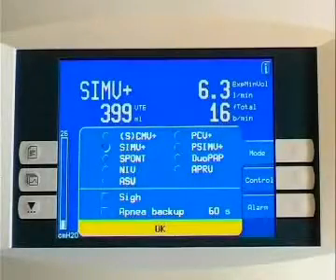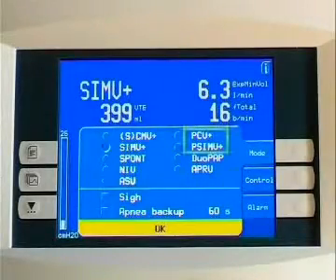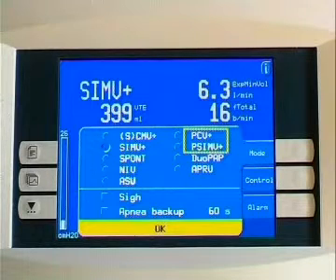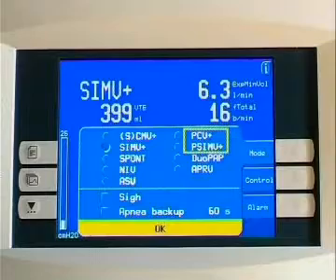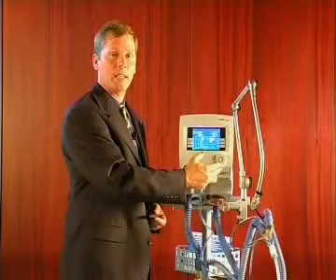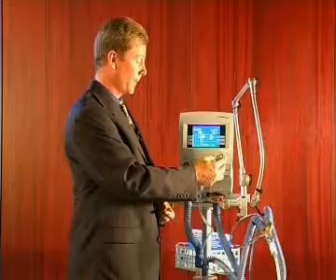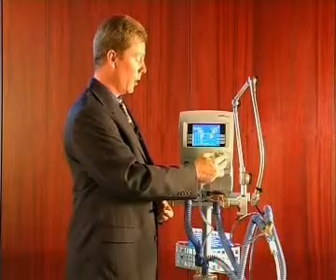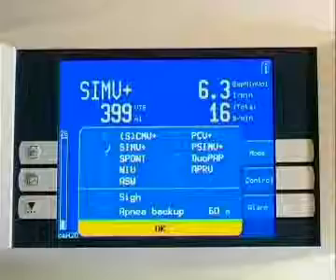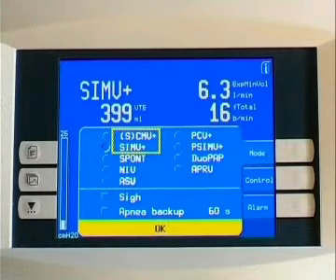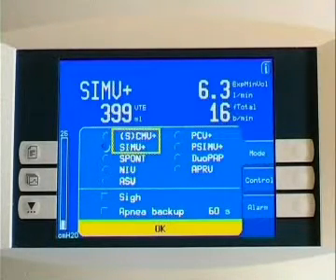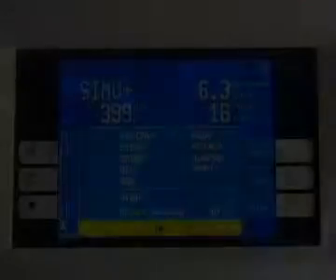The two pressure control modes are PCV+, which is CMV, and PSIMV+, which is pressure control IMV, and would allow pressure-supported breaths in between the mandatory breaths. We also offer two volume-targeted modes: CMV+ and SIMV+, which use a similar algorithm to APV, adaptive pressure ventilation.